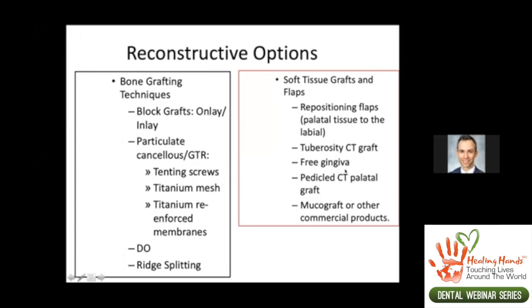Free gingival graft is important, especially when patients have a lack or inadequate attached gingiva to support the long-term health and hygiene around the implants. And yeah, there's some commercially available products.